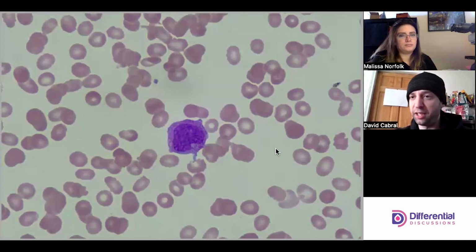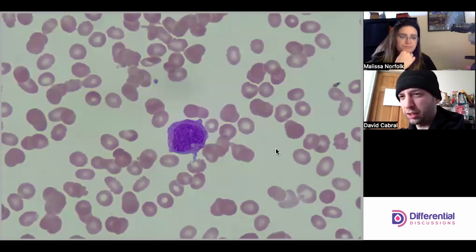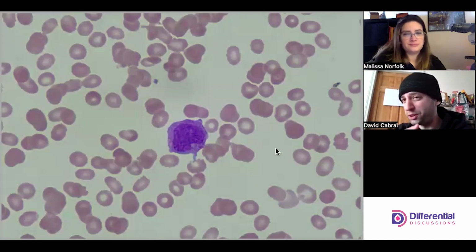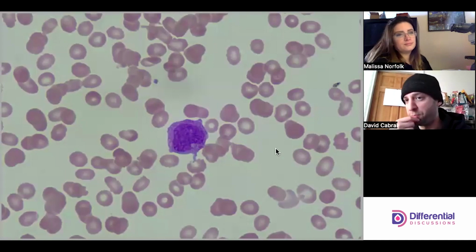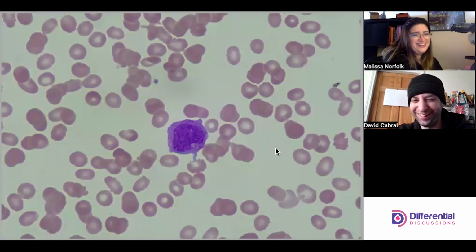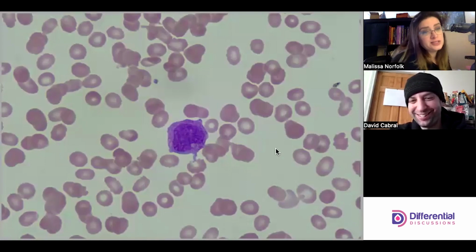And with the help of arsenic trioxide, we can promote apoptosis and reduce the tumor load. And we might be seeing that here. So that might explain why this nucleus looks a little more mature, even though it has some of these malignant features still. I don't think that we're too far into the treatment in this slide, because we'd be seeing some really funky looking cells, and we're not seeing the craziness, thankfully, because those are terrible to look at. But they could be starting it.